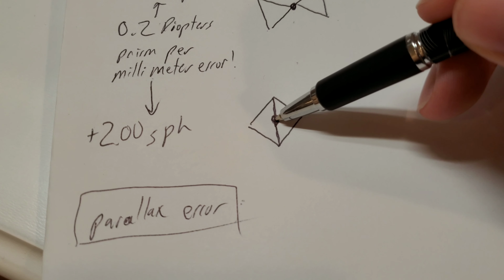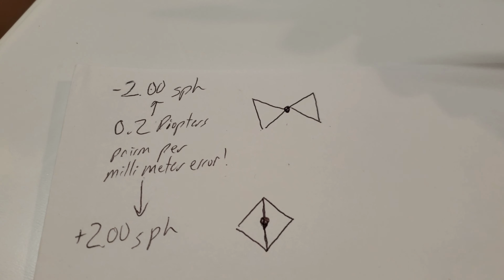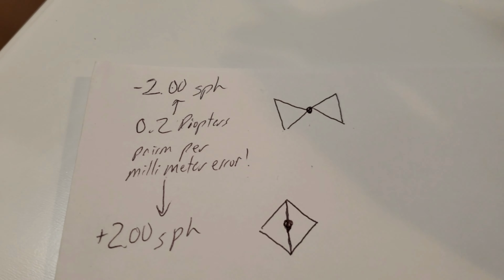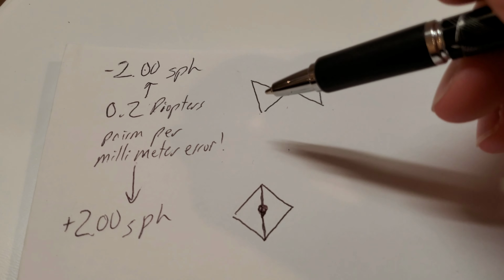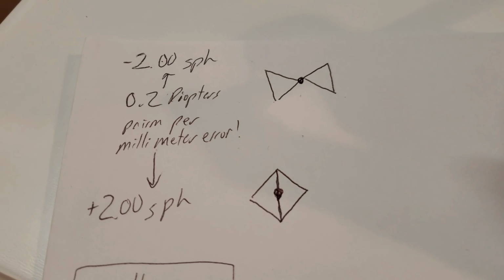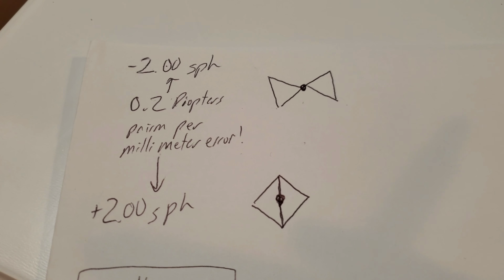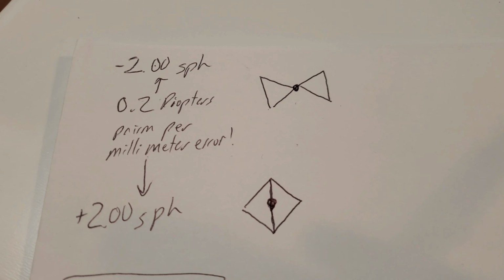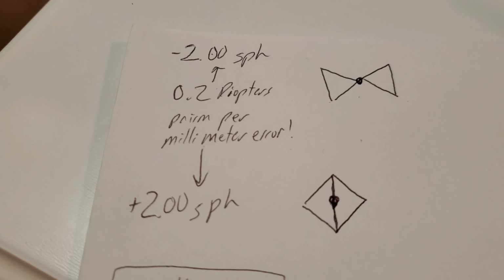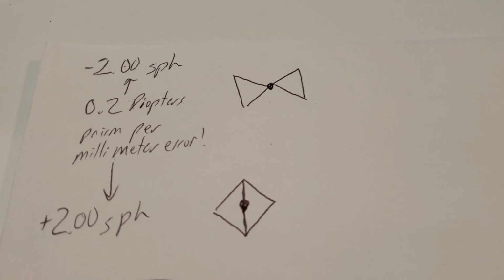In an ideal situation, those are going to line up dead center on both lenses without error. But as we talked about, there are some errors that can compound pretty quickly, and this doesn't even get into all the other measurements, which are panto, vertex, and all sorts of other fun fit measurements that most people don't even take or calculate. And when these things don't line up, bad things happen.